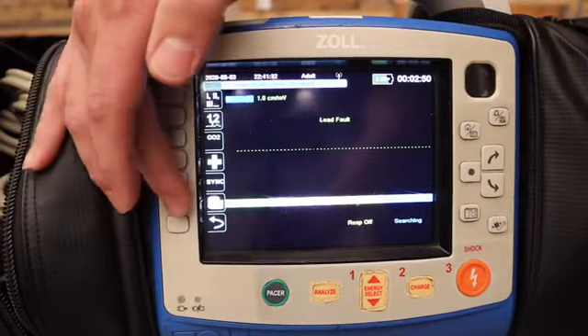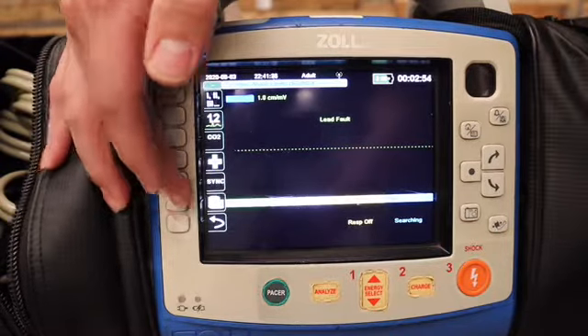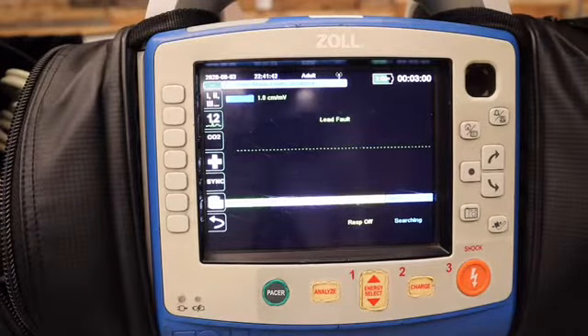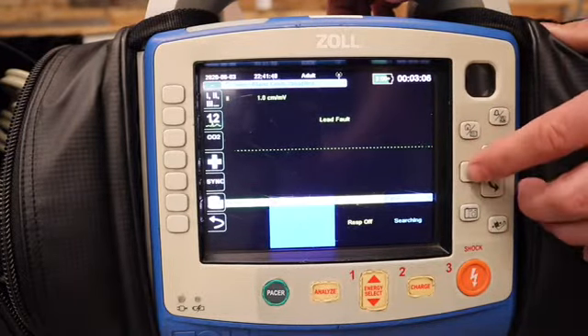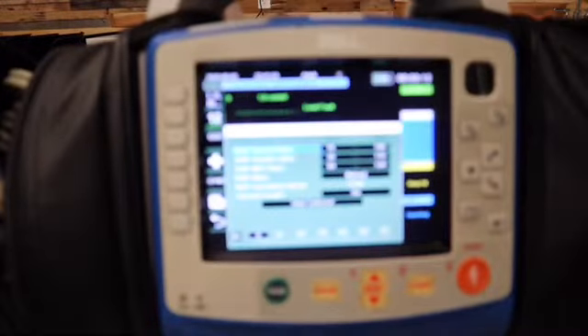This one here we like to call the forever printer. You push it and it is going to continuously print until you push it again. Then what I really want to talk about is the blood pressure cuff system. Down here we can toggle to it, push enter, and it will pull up our screen.